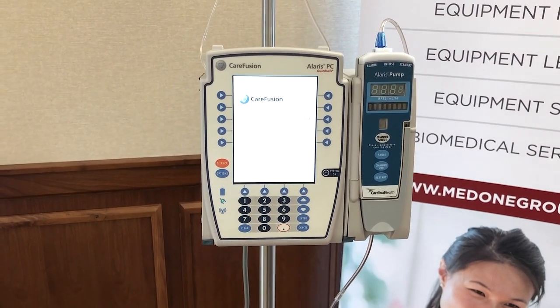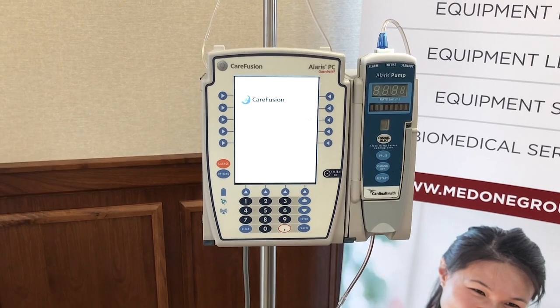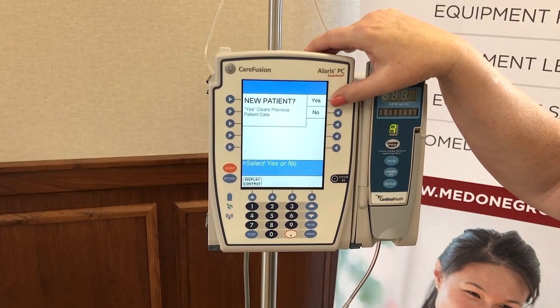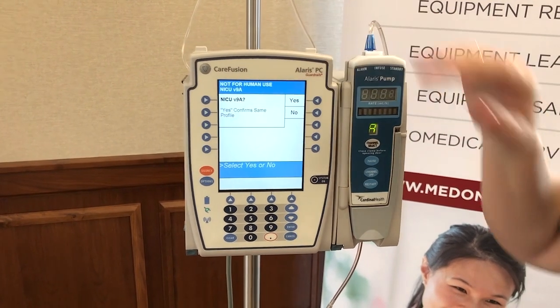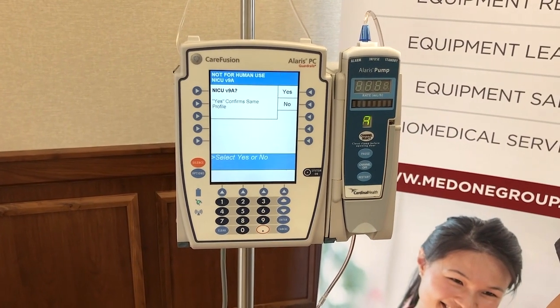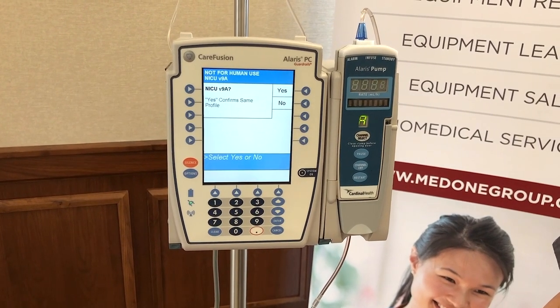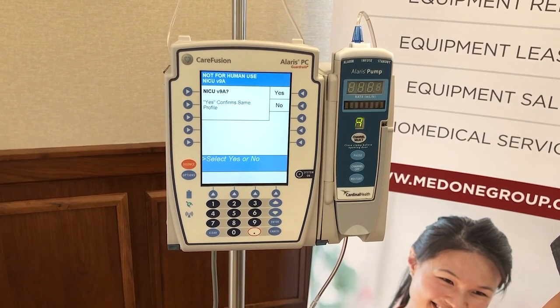The first clinical question the nurse is going to see is 'Is this a new patient?' They will choose the arrow key corresponding with yes, and then they will choose the profile appropriate for where they're working — for example, med surge, critical care, labor and delivery. Your hospital will customize these care areas.